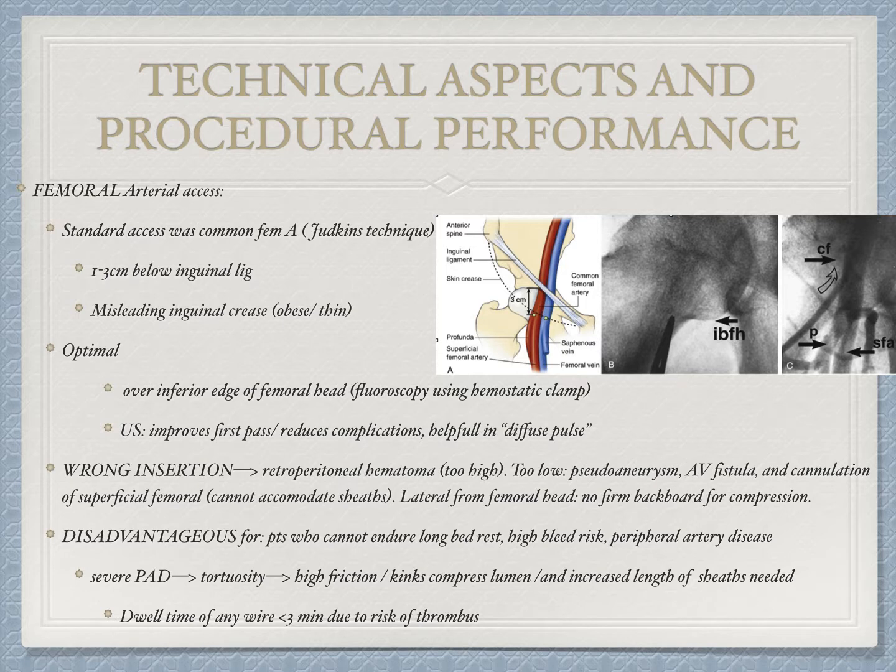You had to puncture, and either of two ways is optimal. One is using fluoroscopy guidance. You can see it in image B. And the other one was ultrasonographic guidance. Both are pretty good and both reduce risk of complications.